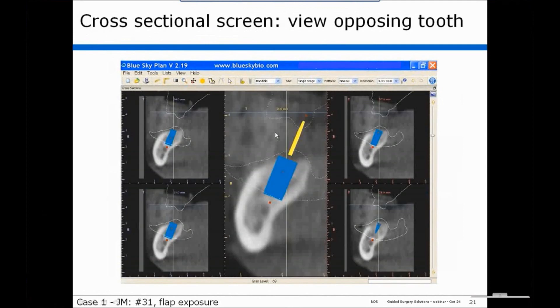We next go to the cross-sectional screen, where you can see the implant is placed. I can see the outline of the crest, which gives some indication of how thick the gingiva is over the implant — and that has implications for the vertical placement of the implant. Secondly, the center line of the implant was arranged to meet the lingual cusp of the opposing molar, as it should be. The mesial-distal orientation of this implant is now set quite easily.